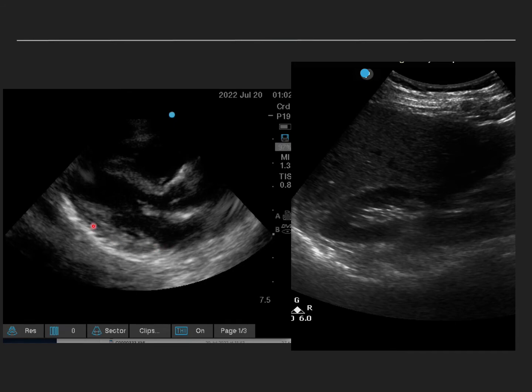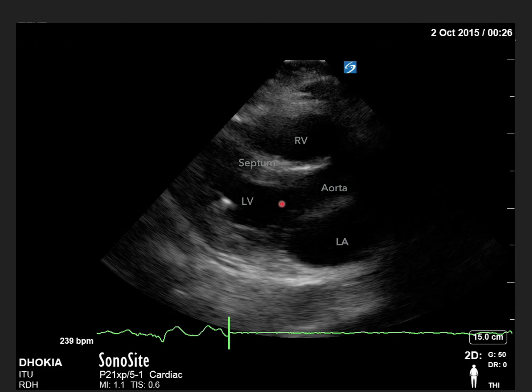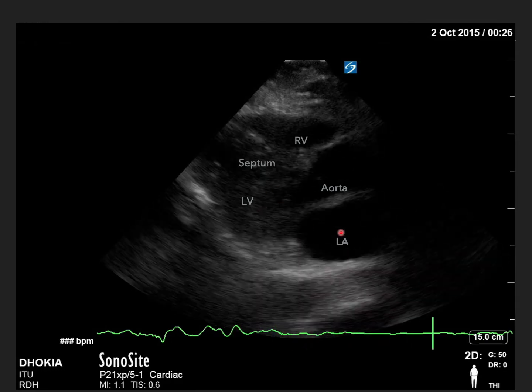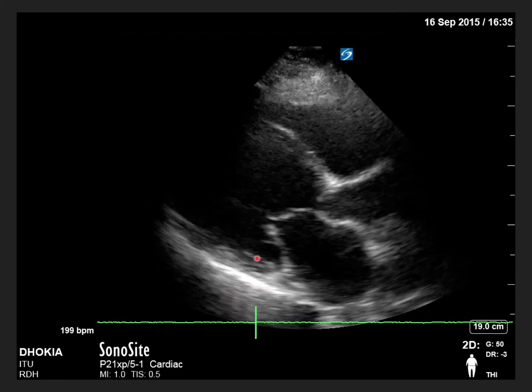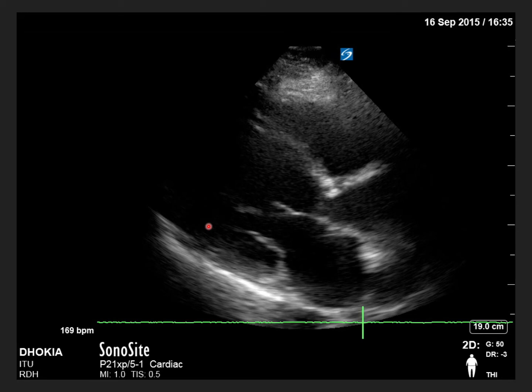In this example we can see the LA, LV, RV, and aorta. The interventricular septum is visible and the left ventricle is completely emptying — indicating good left ventricular function. In this next example, the left ventricle was barely moving — this is a sick heart with poor LV function.